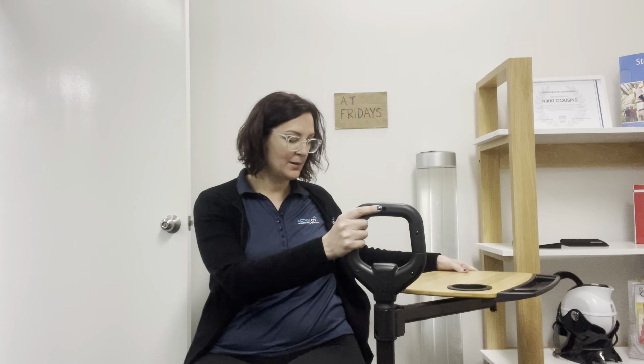Hi everyone, OT Nikki from Action OT for another episode of AT Fridays. This week, bringing you the over bed or chair table, which is a swivel table with support handle and integrated cup tray.